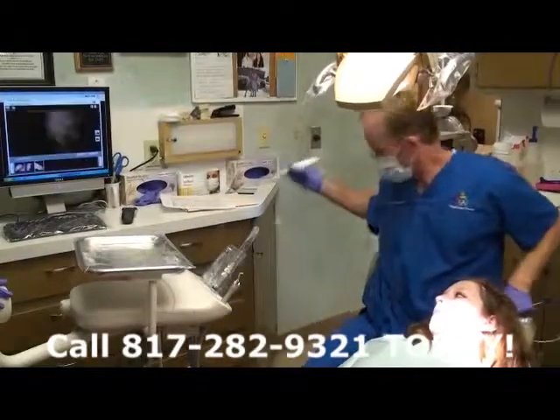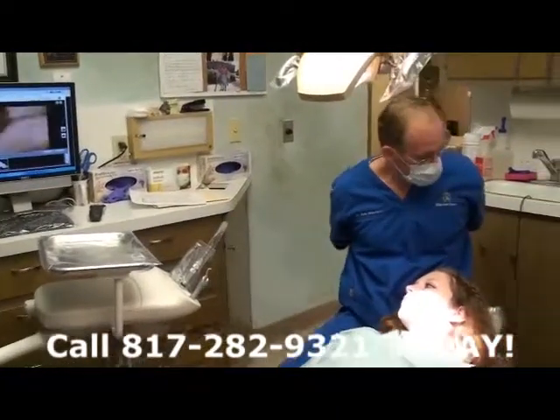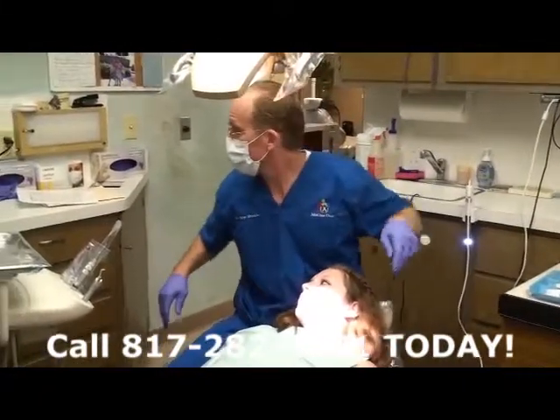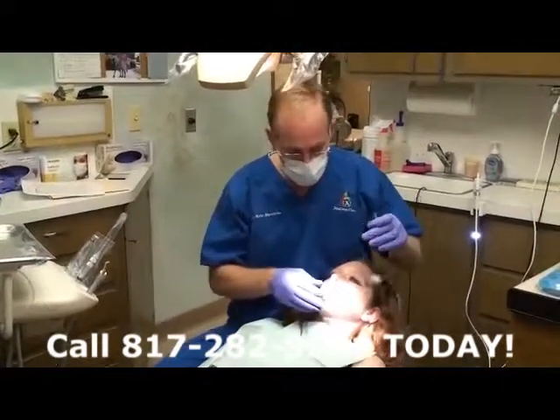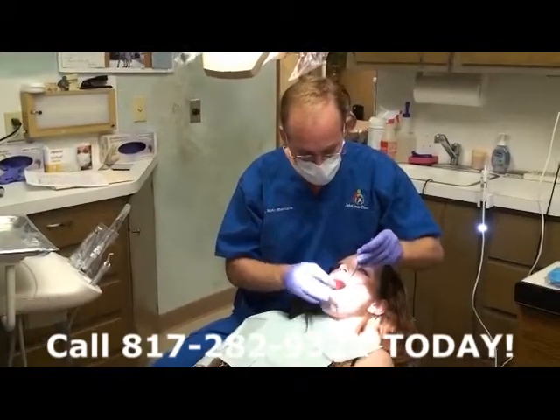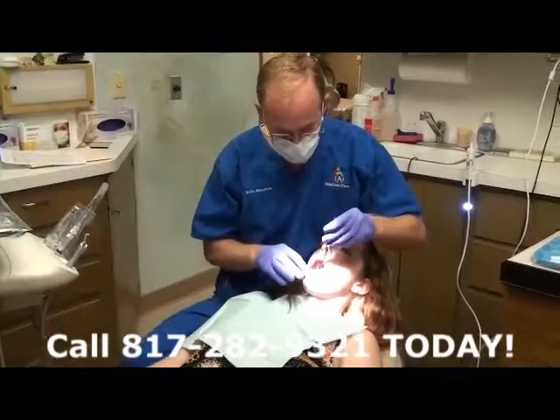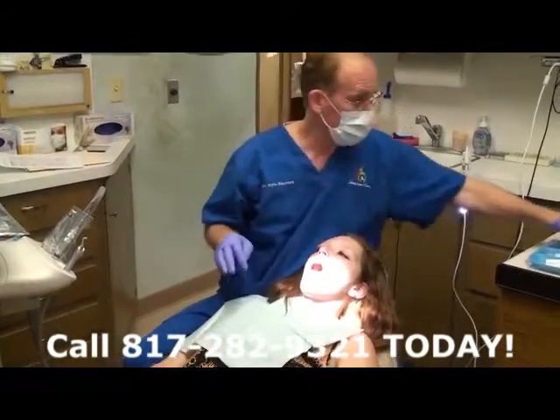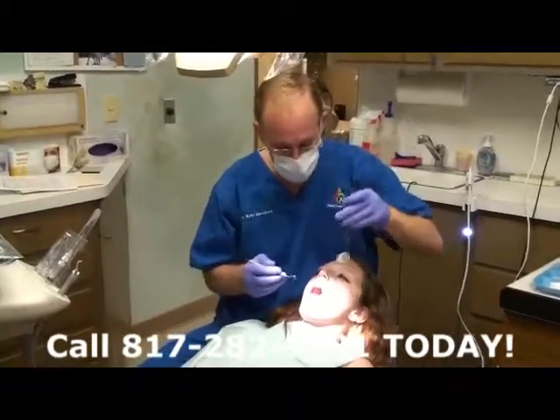Okay, so that's just looking around with the camera. It allows me to see things closer, and you can see it a little bit better than with the naked eye. And then I can show her a couple of those pictures that correspond with her x-rays.